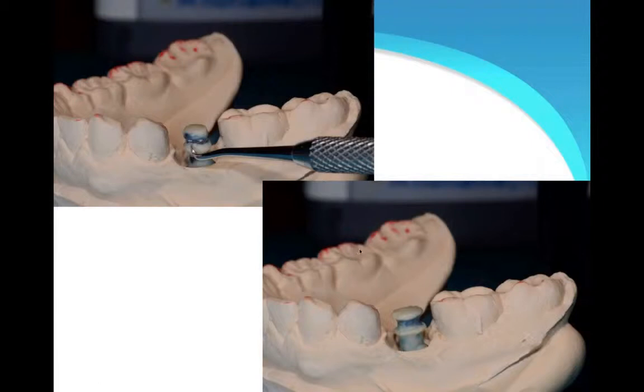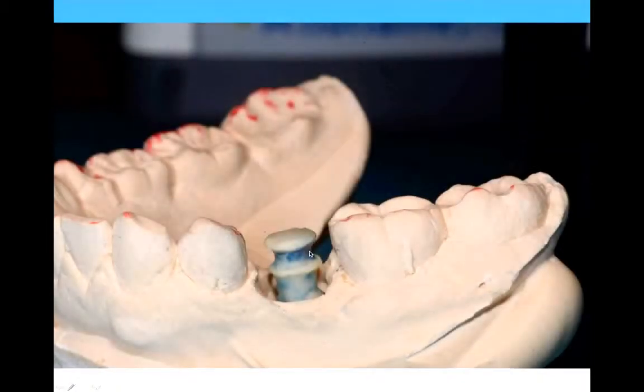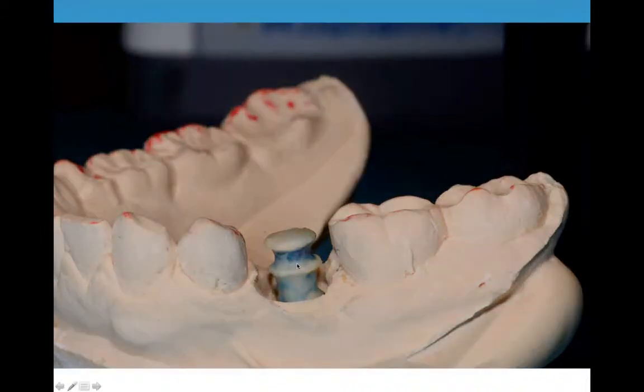Then I started waxing something. I don't know why I waxed exactly what I did. All I was trying to do, you'll see here, is develop an undercut. Nothing to that. Now, there's some luck involved here. I'm going to admit that. And you'll see what it is. So this is basically what I came up with. And I thought, why don't we just make this a surrogate prep? I will put some undercuts in, and that way I won't have thread timing issues because it's all perfectly round. You with me?